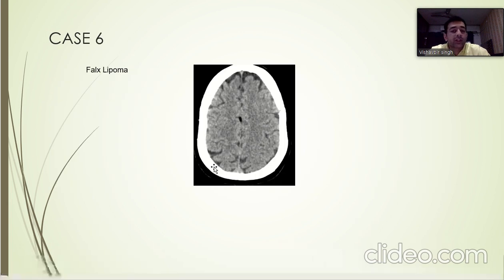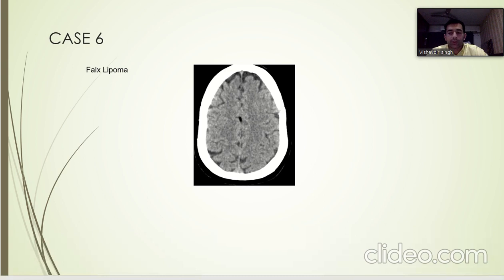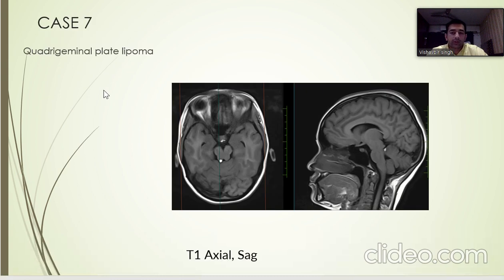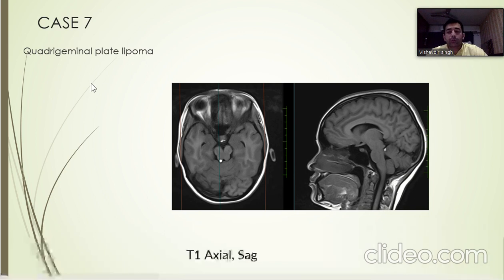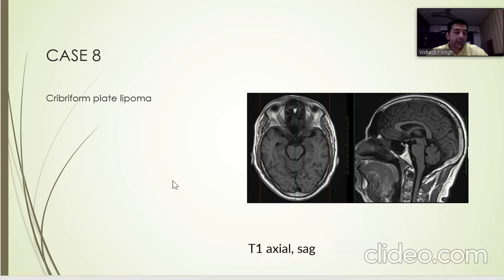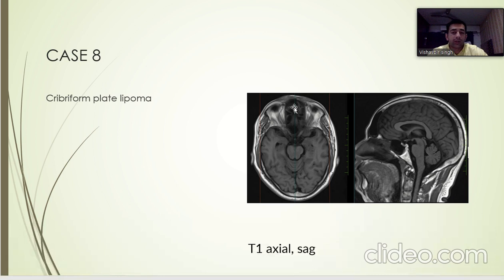Case 6 shows a well-defined hypodense lesion in the falx cerebri, which is a falx lipoma. In Case 7 we can see a well-defined hyperintensity in the right quadrigeminal cistern corresponding to a quadrigeminal plate lipoma. In Case 8 we can see a triangular-shaped, well-defined hyperintensity in the cribriform plate corresponding to a cribriform plate lipoma.